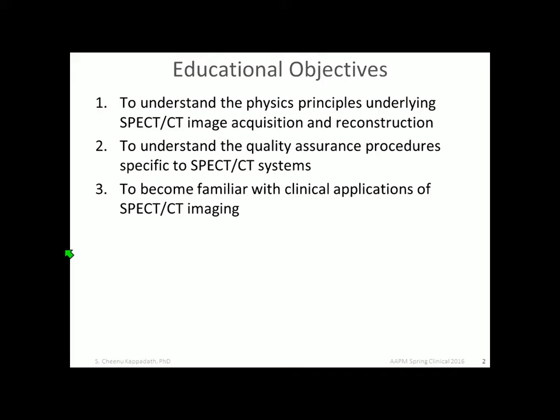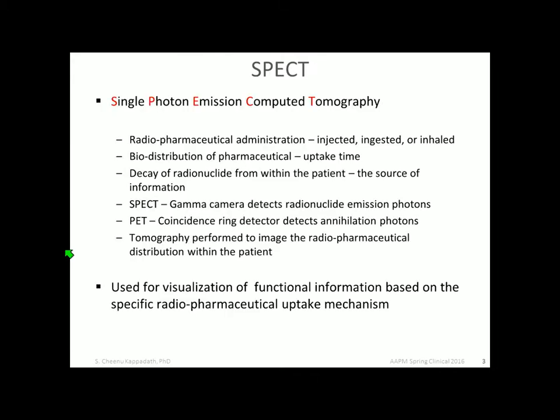One of the task groups at AAPM is considering SPECT-CT, and I will end with some clinical applications that we are seeing in the clinic right now. SPECT actually stands for Single Photon Emission Computed Tomography, so it is basically an acronym here.